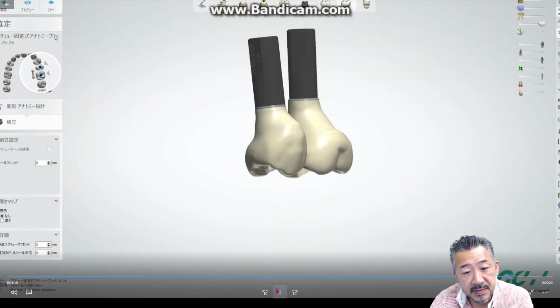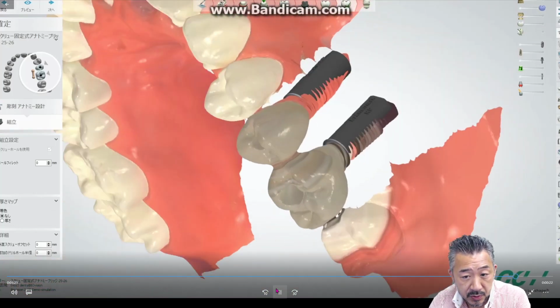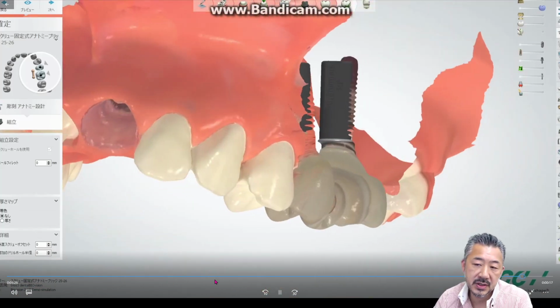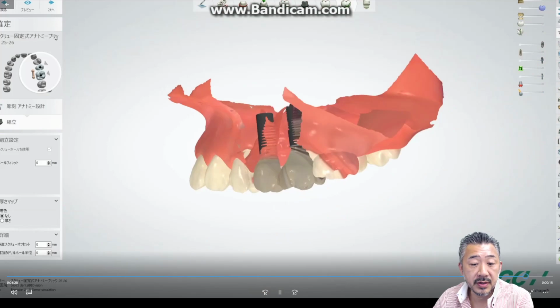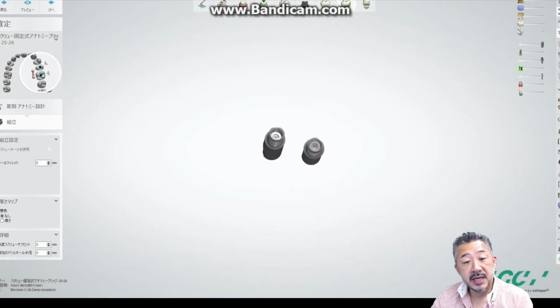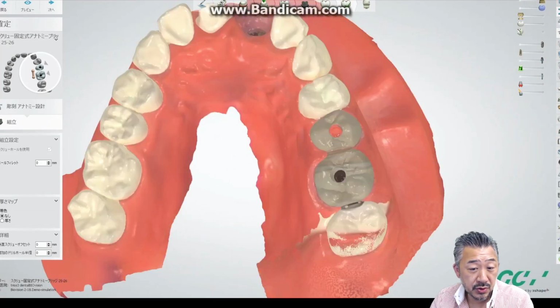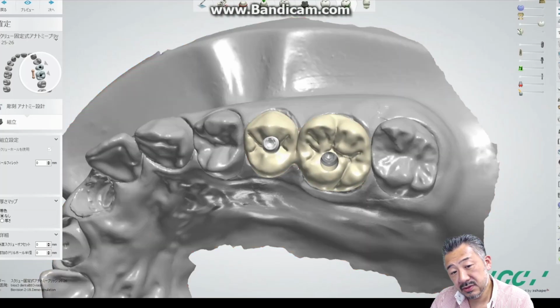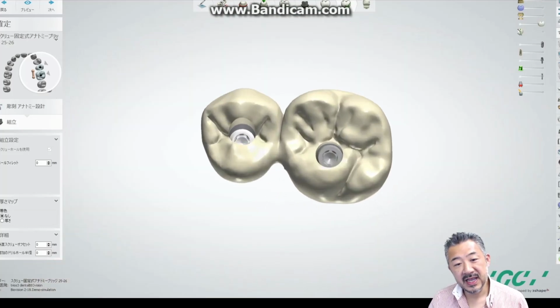Okay, this is a method to reproduce the implant provisional sub-gingival area when performing an intraoral scan using TRIOS. I just want to ask you, do you still think the analog style is more accurate and easier? I know the answer without saying.